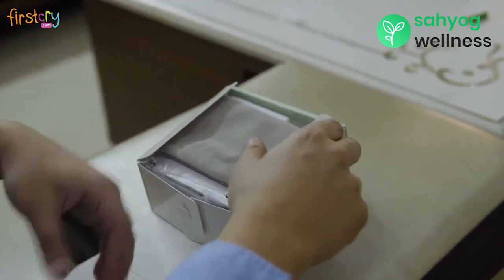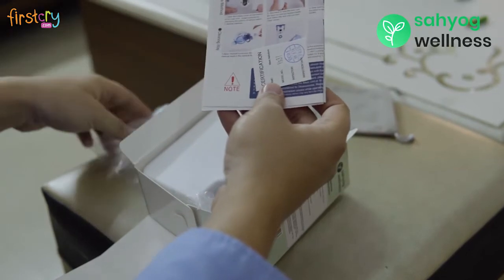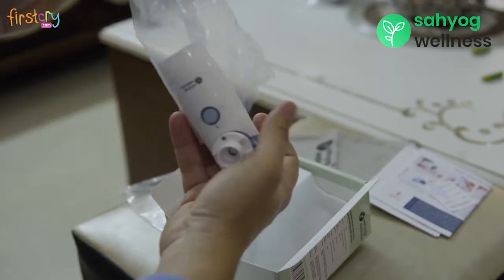This device is designed to deliver medication prescribed by a physician to the airways of lungs for adults and kids.